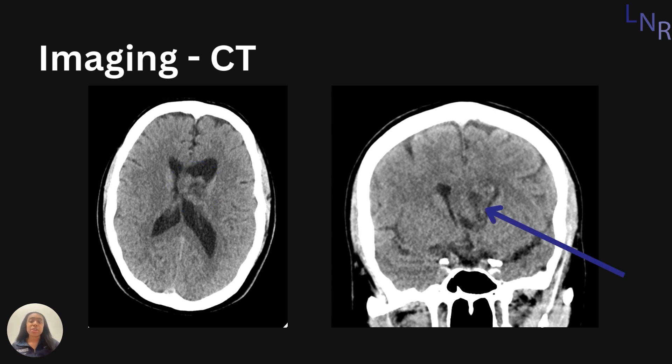In the coronal view, we see the mass inside the patient's left ventricle again. It sits along the septum pellicidum, and you can also see the apparent cystic areas within the tumor.